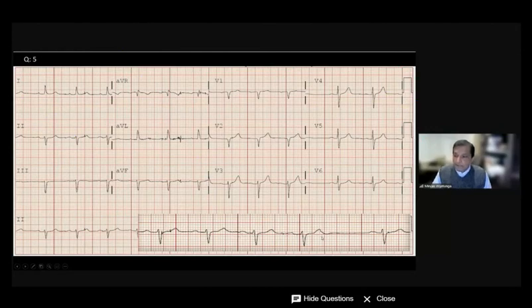But this is very subtle. This is what I'm coming at. Sometimes you might question whether it's true or not. At least most of you will agree, this T wave looks, see, it's a small hump here, probably this little sharp point here. It's very subtle. I don't know whether a human eye normally can do that. Maybe the young eyes can see it better than my eyes, but there is a subtle change. And that's a P wave that's hidden there.